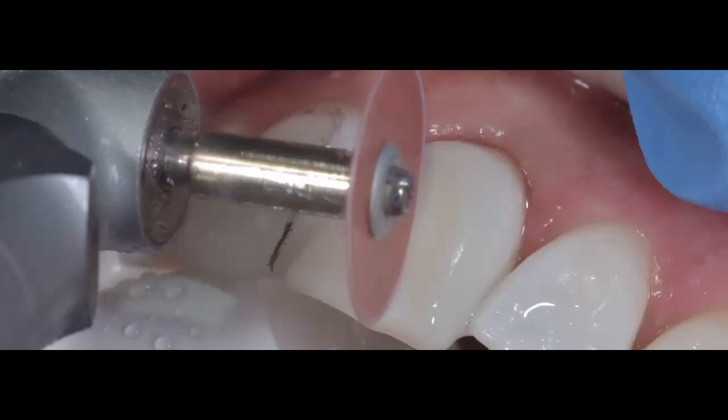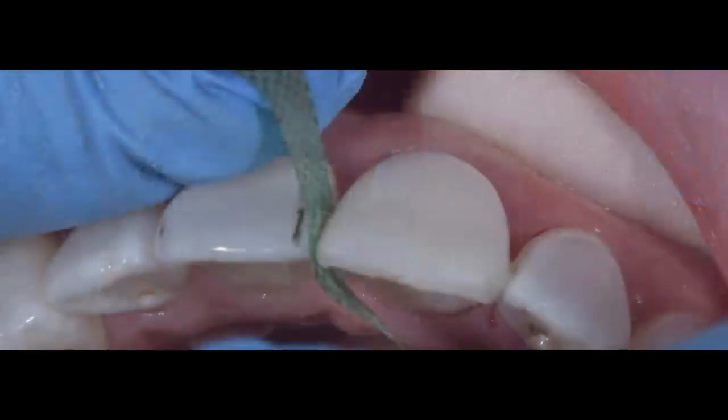And I only use the coarse and the medium disc. Everything else is going to be done with burs, specifically the 8888 diamond bur, and then polishing directly with a ShapeGuard that is also made by Coltene. Again, I have another webinar on finishing and polishing composites that you can watch, and you will see me do it step by step. I'm not going to talk about that specifically here, but that's what I'm doing. I'm just going into finishing and polishing. I'm going to use the Epitex also to get into my interproximals.